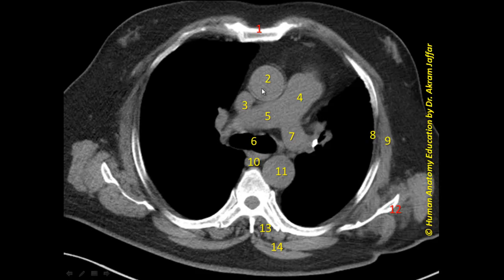We can see the ascending aorta and the descending aorta. This is the pulmonary trunk dividing into the right pulmonary artery and left pulmonary artery. Here is the superior vena cava on the right side. Also, behind the pulmonary trunk, we can see the trachea, and it is clear that the trachea is starting to bifurcate.